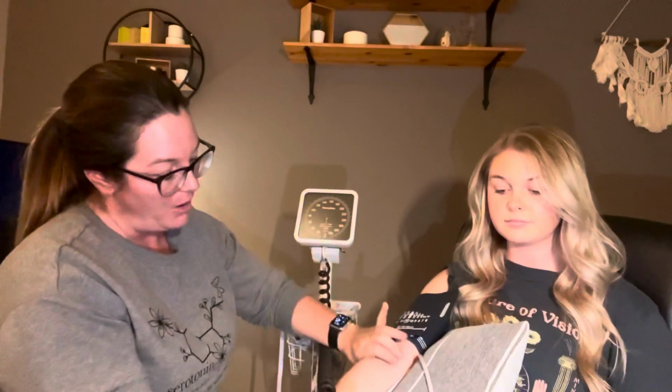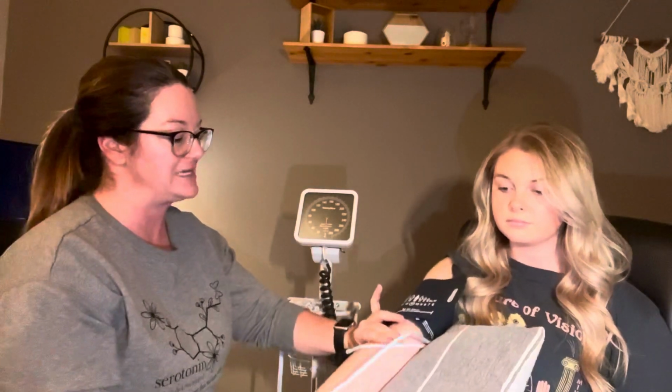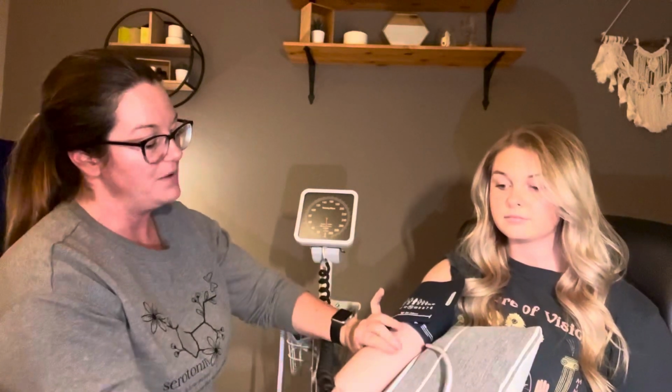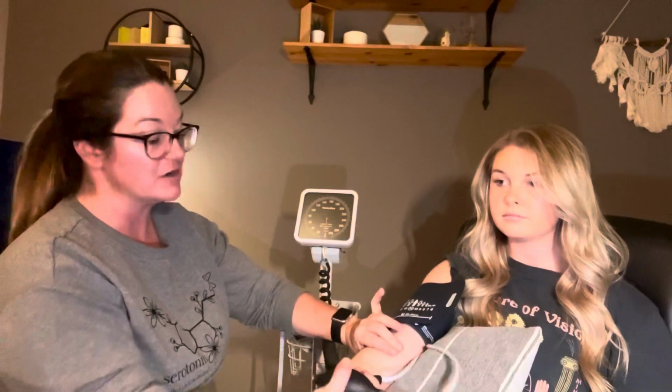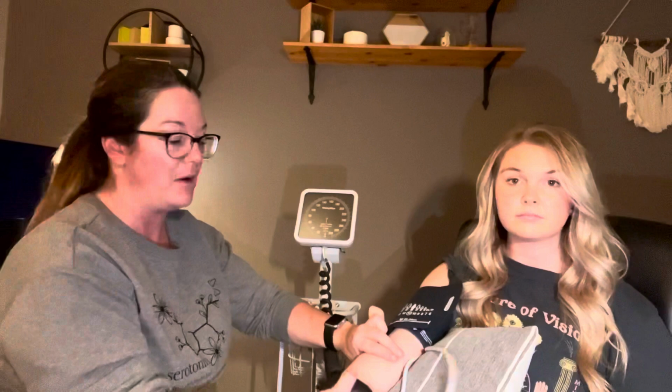I wanna make sure that my valve is closed, but not closed so tightly that I can't open it with one hand. And I'm gonna palpate that brachial artery, okay? Something that can help you find this is if the patient slightly hyperextends their elbow, you should be able to feel it on that inner side of the antecubital fossa. Now, when you're in your OSCE, if you're palpating for a brachial artery and you just can't find it, that's okay.